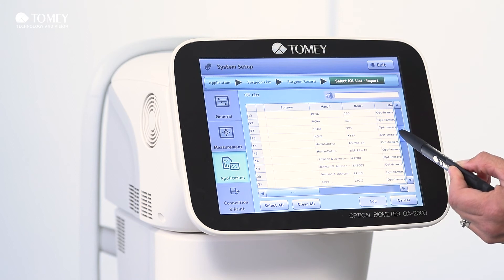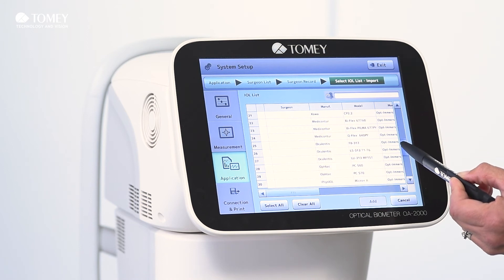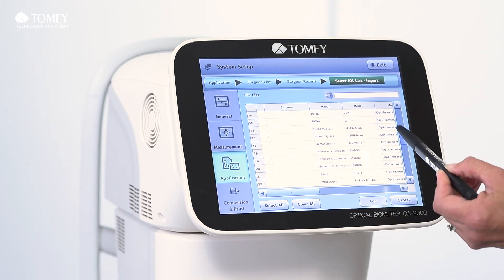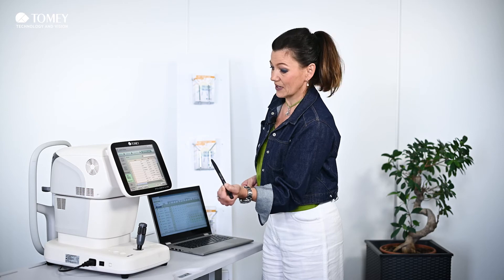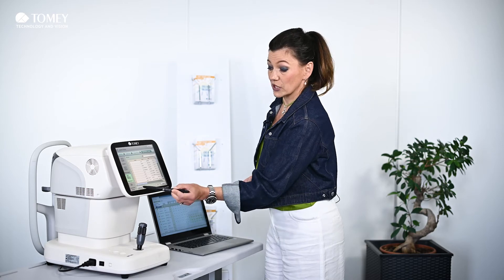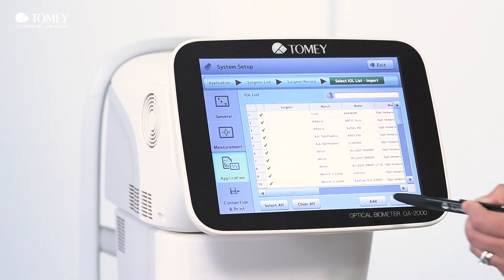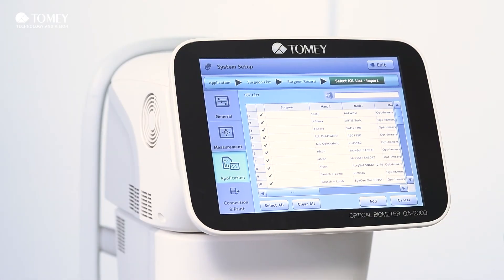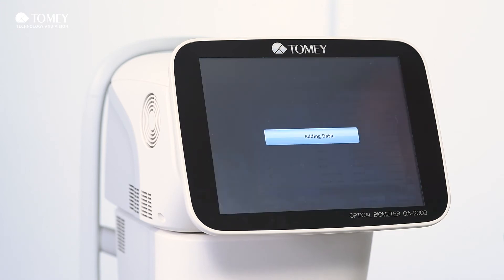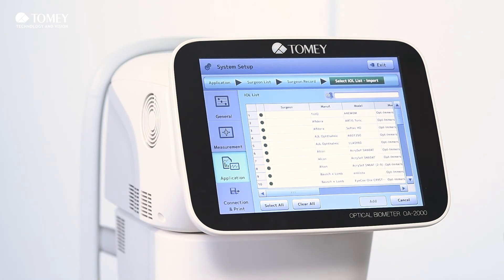Here you have the list from all the selected manufacturers and your preferred models. Now you click "select all," press add, and then they are added to your surgeon name. This is how simple it is, and then you can share the data with other surgeons, for example.